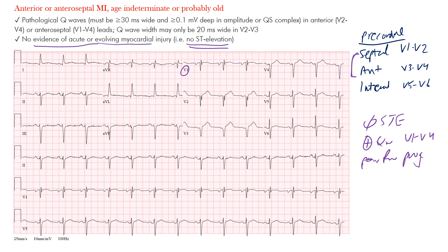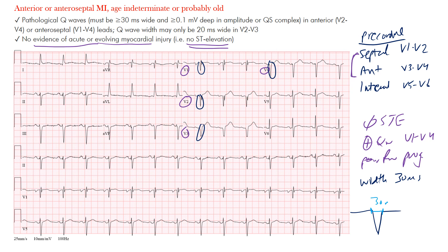The pathological Q waves should be localized to leads V1 to V4. Notice these deep, wide Q waves in V1, V2, V3, and V4. For width, we want at least 30 milliseconds — from the beginning to the end of the Q wave. For depth, at least 1 millimeter, though it tends to be deeper in practice. Be cautious about calling 1 mm sufficient, especially early on, as normal septal depolarization can produce small Q waves in lateral leads. Look for deep, wide Q waves.